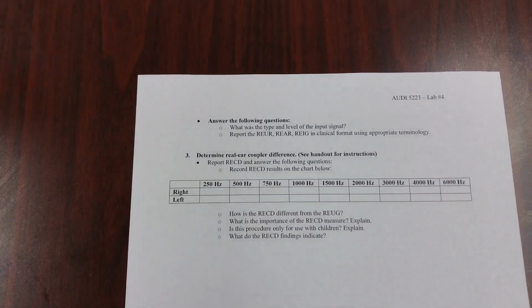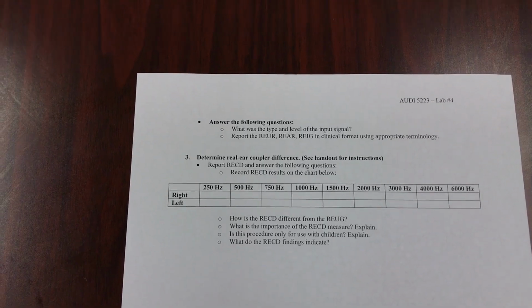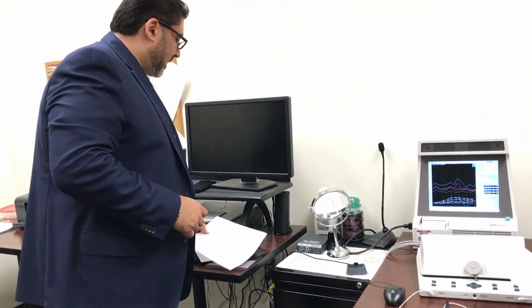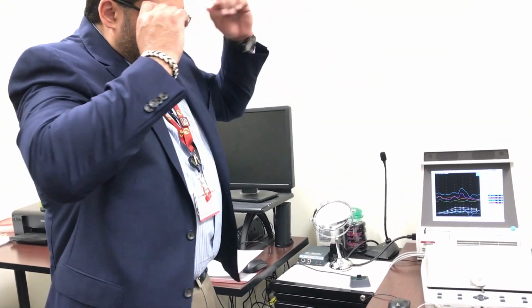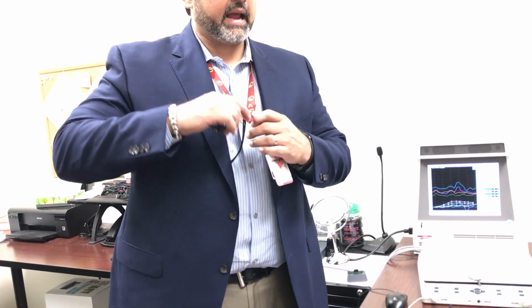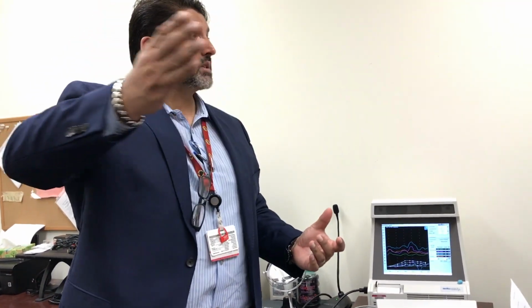And then what I want you to do is write this in clinical terms. So you're going to go in and say, I tested Clayton's open ear canal, and the peak resonance was between A and B, and it's this level. It's between this and this level. We put a hearing aid in. This is the model. This is the serial number. And at 50 dB input, this is the response we get.